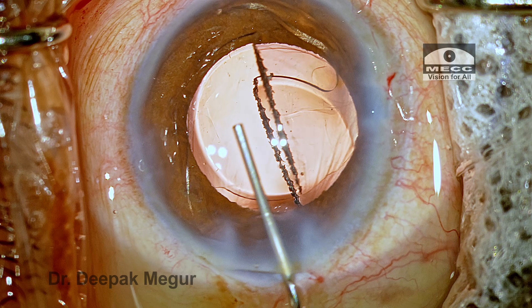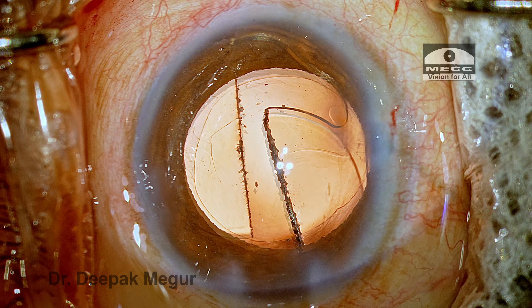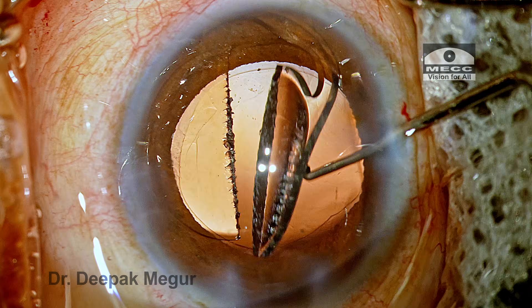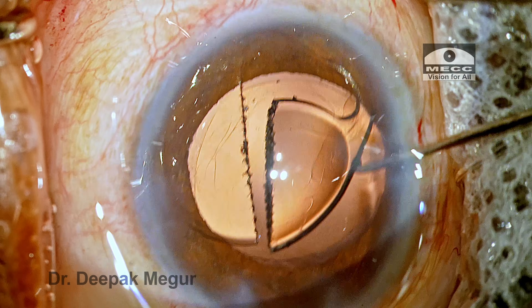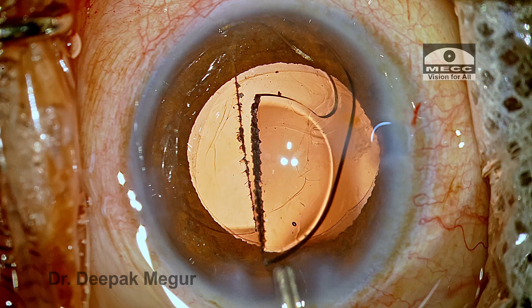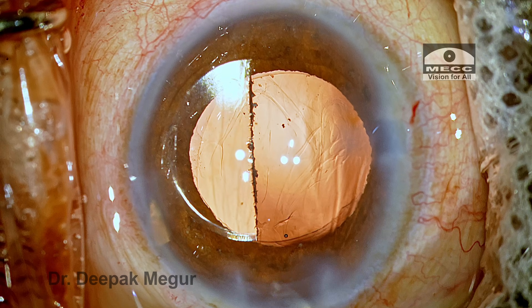Sodium hyaluronate is placed into the anterior chamber and also in the bag. Now the two halves need to be oriented appropriately before pulling them out. The haptic should always be on the right side with its convexity facing right before extraction. This first half is already oriented the way I'd like — so when I pull out the lens, there is no entanglement of the haptic in the wound, and it comes out easily.